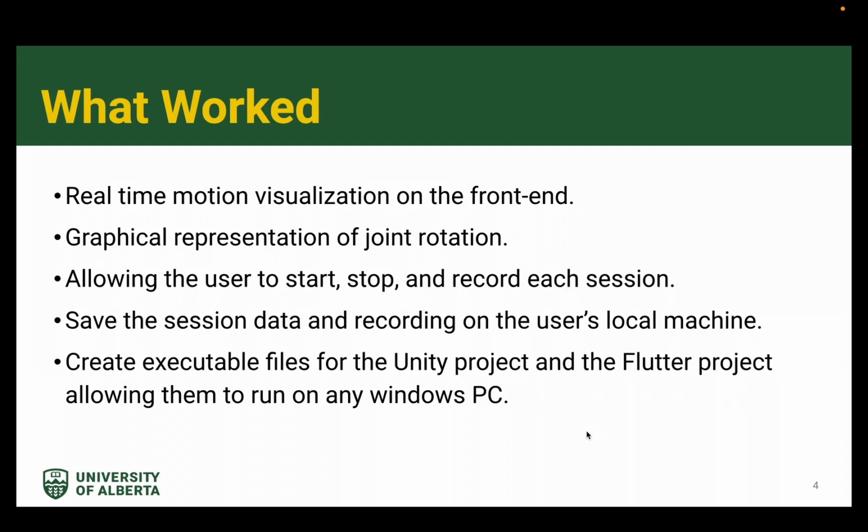For our project, we were able to do real-time motion visualization on the front end of the user's local machine, to allow users to see the 3D human model's movements mimicking the movements of the subject wearing the sensors. We were also able to do graphical representation of joint rotation in the form of roll, yaw, and pitch graphs, and these values are basically rotational values on the X, Y, and Z axis.